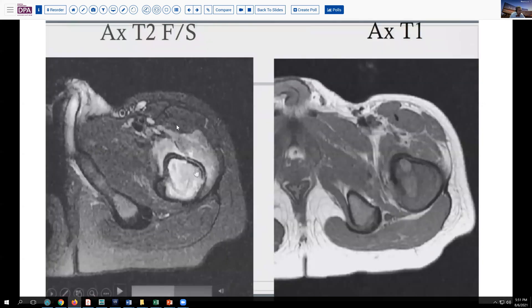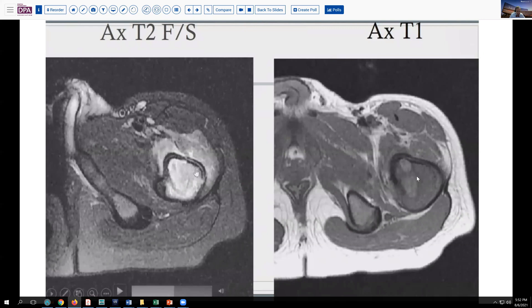The radiologists get their chance to evaluate these things more carefully with additional studies. Here we see the MRI showing that this is quite bright on T2 imaging. We also see that the surface of the cortex is reacting and elevating — this may be typical of a Codman's triangle type of cortical reaction. Here we see the surrounding muscle also showing some edema and secondary changes. On the axial T1 lesion, we see this alteration and variability internally, some heterogeneous density and variable dark spaces and changes to the cortex, indicating cortical damage.